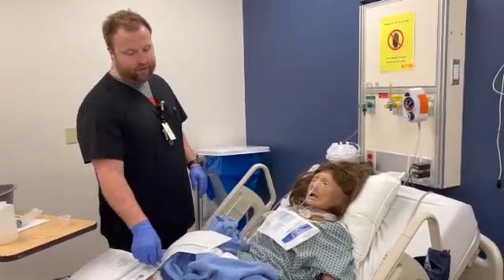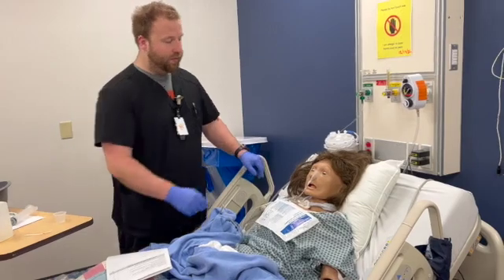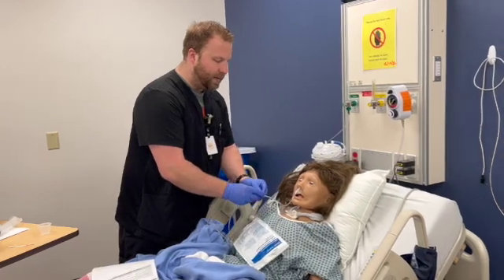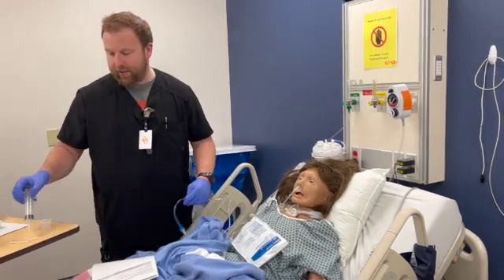I will put on clean gloves. I'm going to discontinue my suctioning or feeding if I had it on. I will remove my tape and my pen here. I want to make sure that, one last time, I verify the placement of my NG tube.